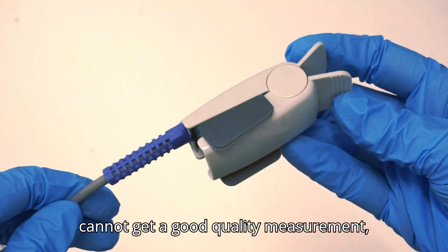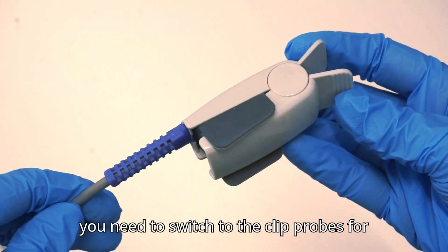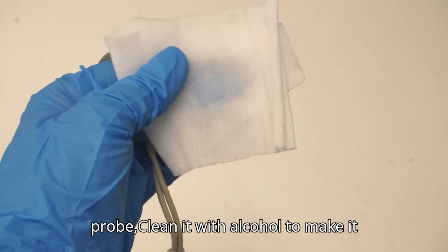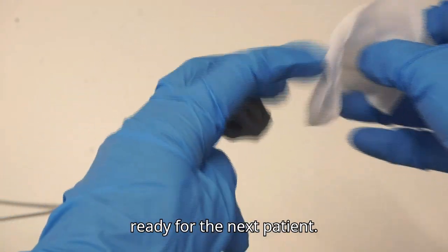If you cannot get a good quality measurement, you need to switch to the clip probes for a better result. When you remove the probe, clean it with alcohol to make it ready for the next patient.